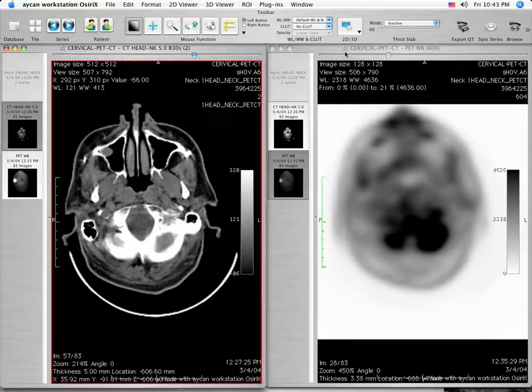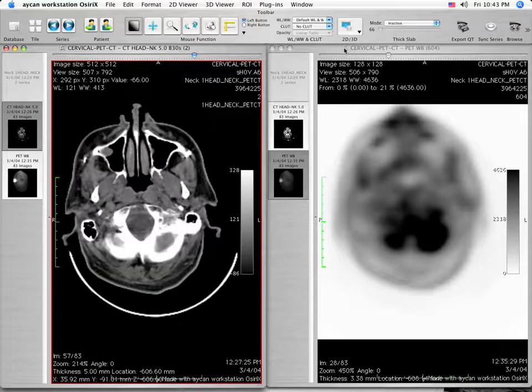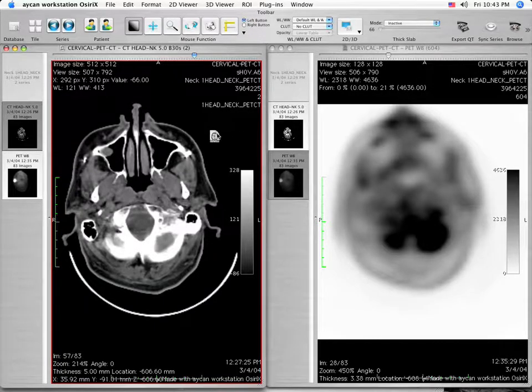Place your cursor over the DICOM icon to the left of the PET series description in the title bar above the images. The icon is very small and looks like an axial head. Hold the left mouse button over the icon as you drag it to the CT image area, then release the mouse button.